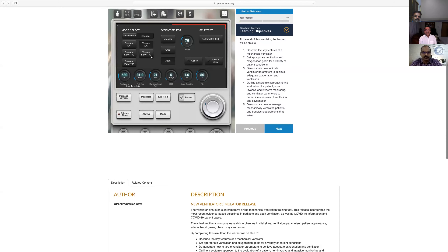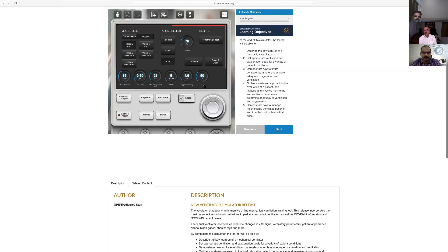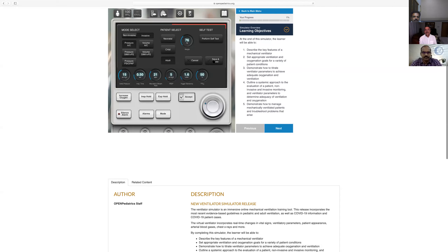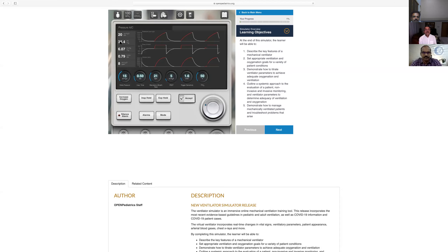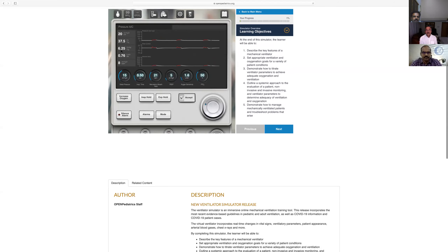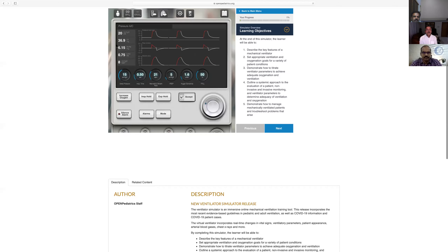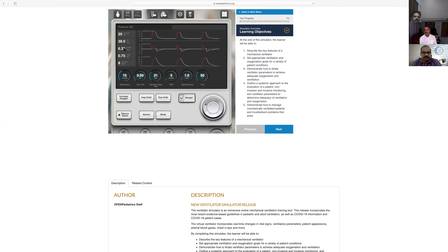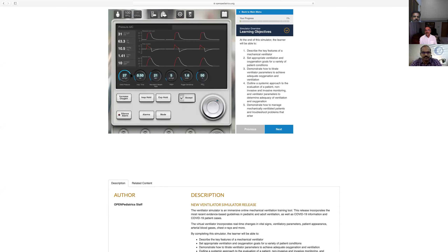Now I'll go for a pressure mode. See — there is no tidal volume button here. That is what I have been telling you. In a pressure mode, to adjust the tidal volume, I have to change my pressure. If I see the peak expiratory flows around 5.92 liters and I am not happy and getting a tidal volume of 200 ml, there is no tidal volume button. I have to tell the ventilator to give more pressure space. The only way you can increase tidal volume in a pressure mode is by altering the pressure.